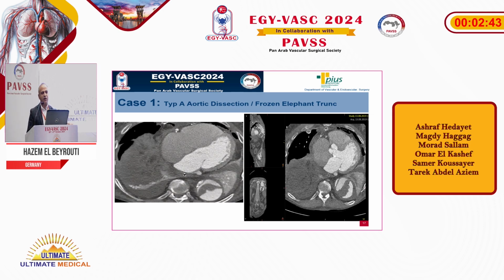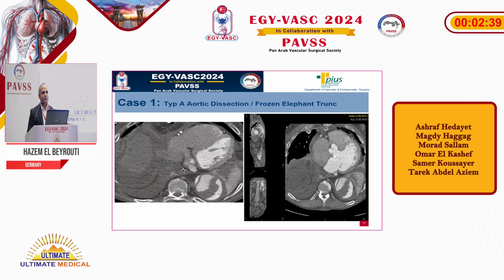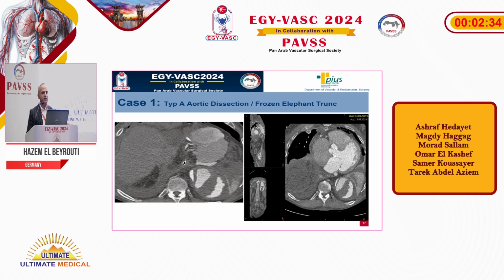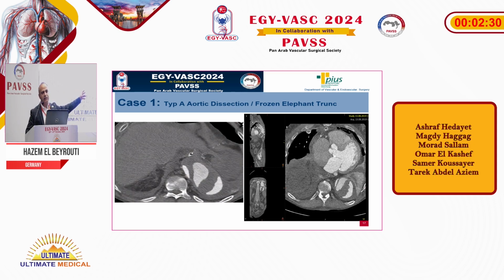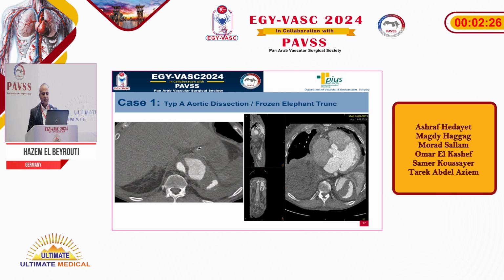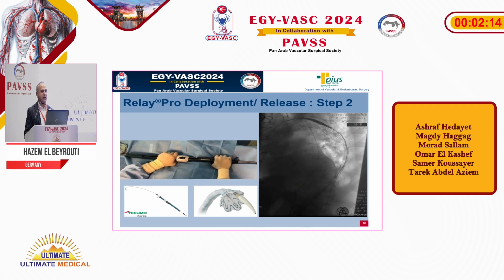After 4 hours in the intensive care unit, the patient was unstable. We performed an emergent CT, and as you can see here, the false lumen had ruptured with true lumen collapse. So I took the patient directly to the operating room, and as you can see here, I performed distalization of this TEVAR with a 250 millimeter TEVAR down to the celiac trunk.